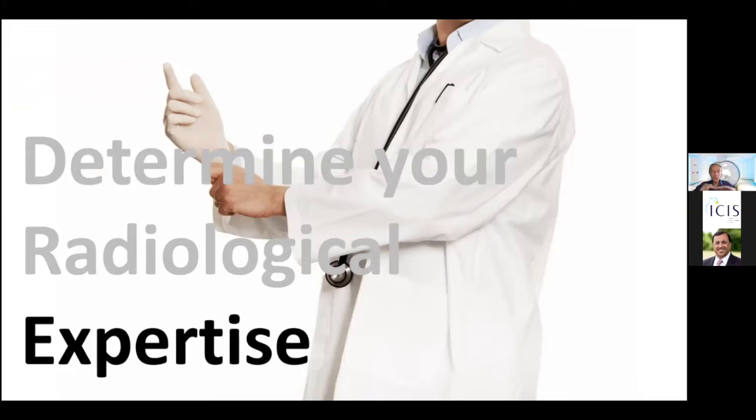When you do this for a couple of weeks, see if you notice a difference. If you don't see a difference, you may consider not using contrast. But you need to be sure of good quality, and you need to be sure that the patient is in the appropriate category, as I told before, to omit contrast.